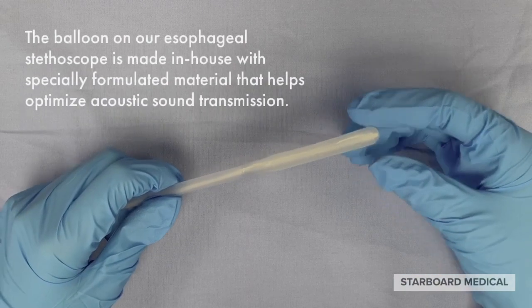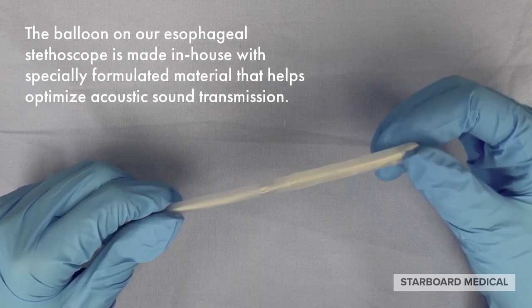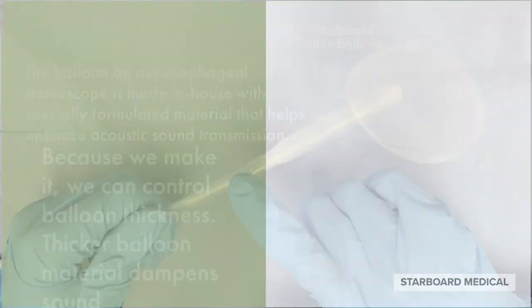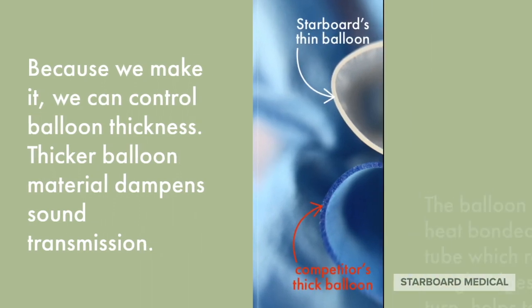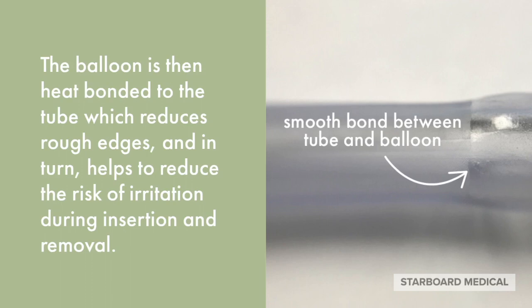The balloon on our esophageal stethoscope is made in-house with specially formulated material that helps optimize acoustic sound transmission. Because we make it, we can control balloon thickness. Thicker balloon material dampens sound transmission. The balloon is then heat-bonded to the tube, which reduces rough edges and in turn helps to reduce the risk of irritation during insertion and removal.